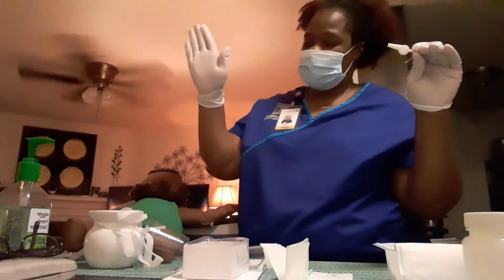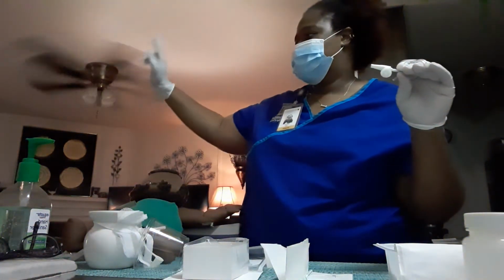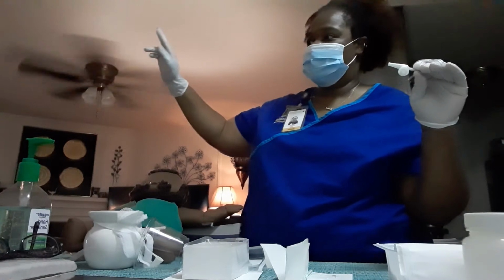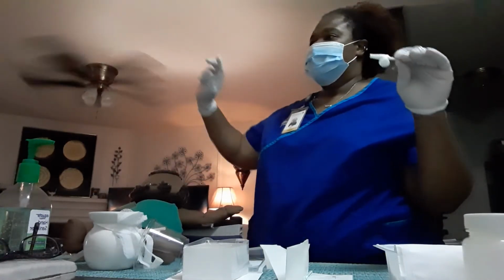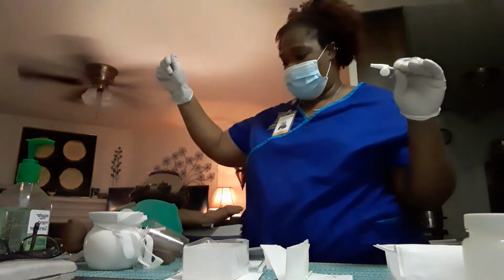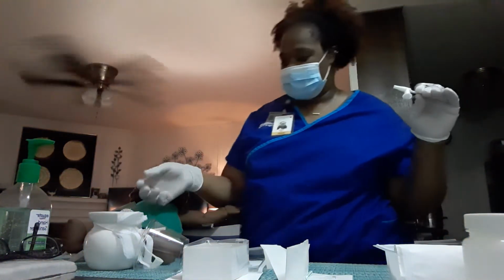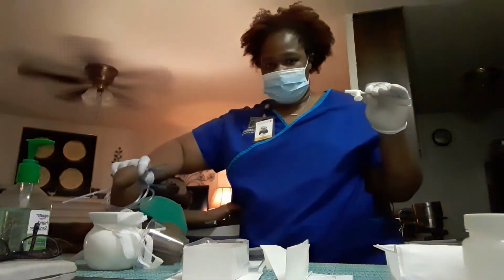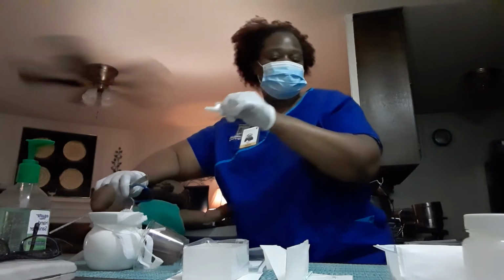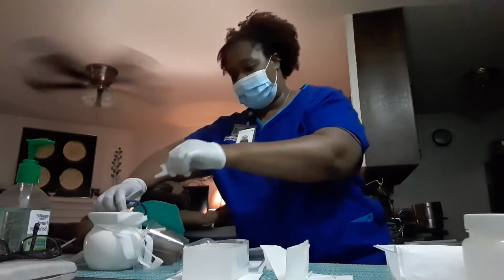With my non-dominant hand, I'm going to adjust the suction regulator between 100 and 120 millimeters of mercury pressure. I'm going to turn the regulator on, and I'm going to connect my suction tubing to the wall suction.